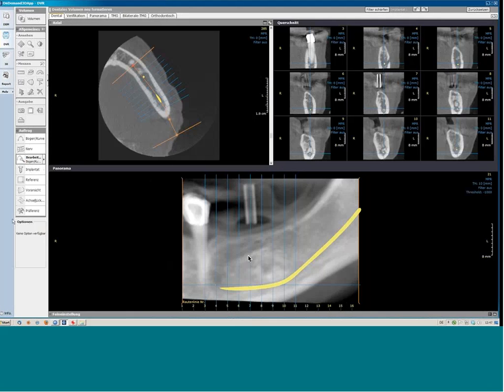But just remember these metal balls and compare it to this situation. Here we see a simple reference splint for the left lower jaw. We see a very small volume, just the part of the lower jaw was acquired. And you see that finally in the image I just cropped out this area I need.